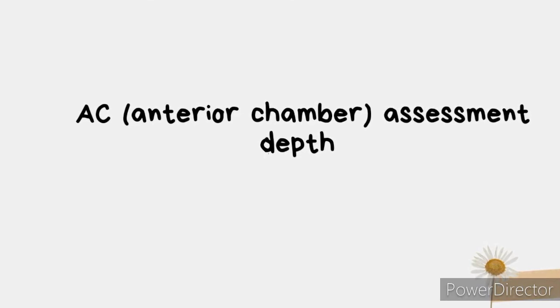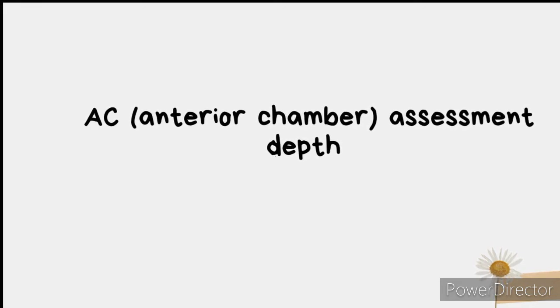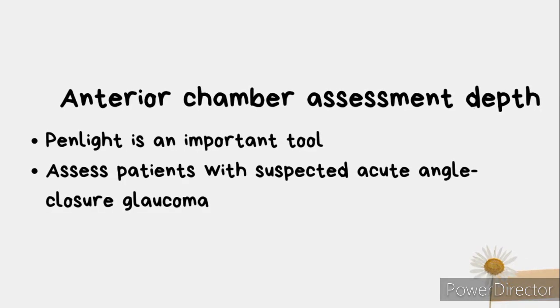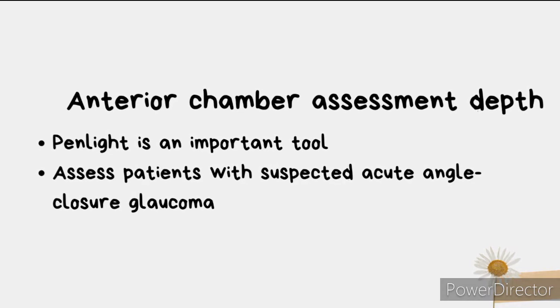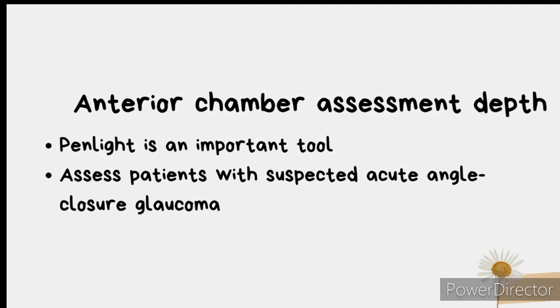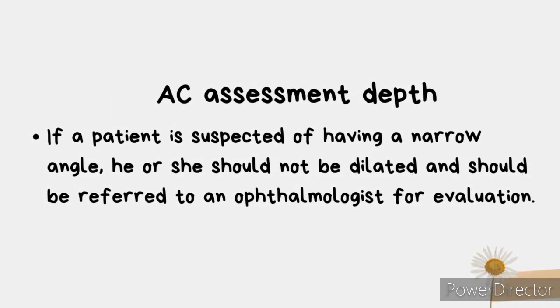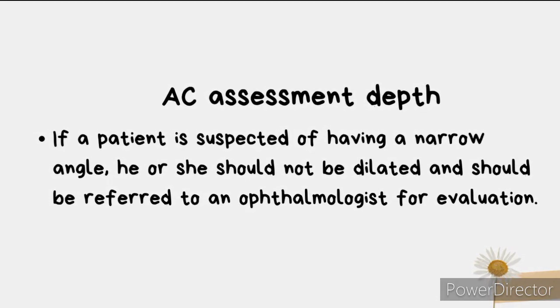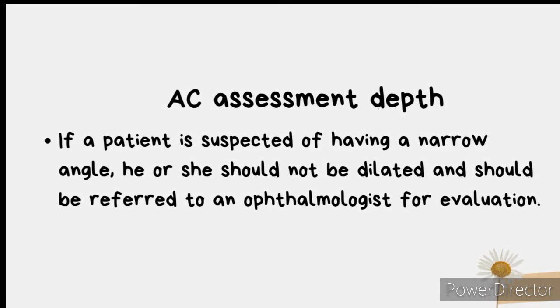Today we will discuss the AC assessment depth, or your anterior chamber assessment depth. The anterior chamber assessment depth requires the penlight, and this assesses patients with suspected acute angle closure glaucoma. Warning: if a patient is suspected of having a narrow angle glaucoma, he or she should not be dilated and should be referred to an ophthalmologist for evaluation.